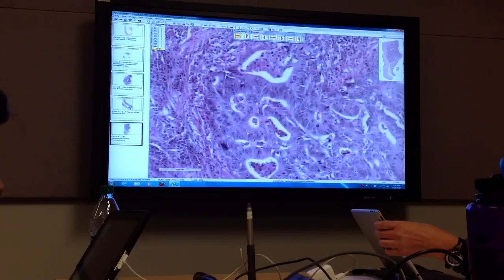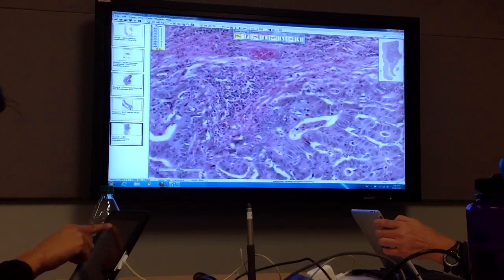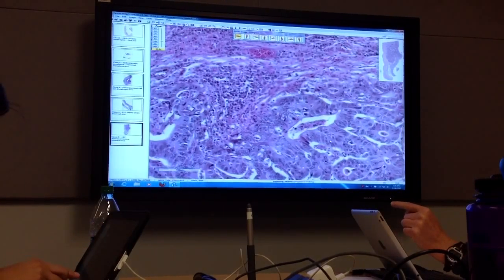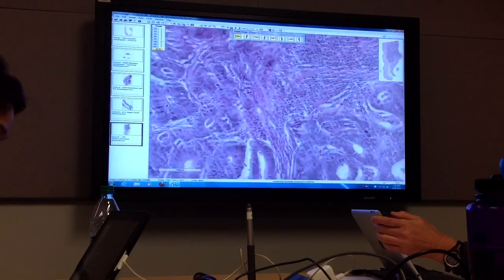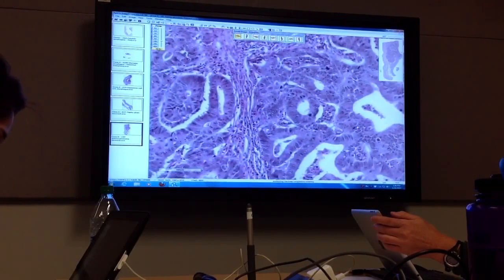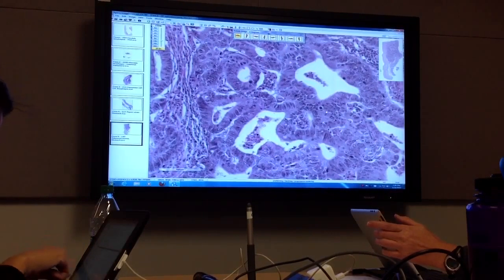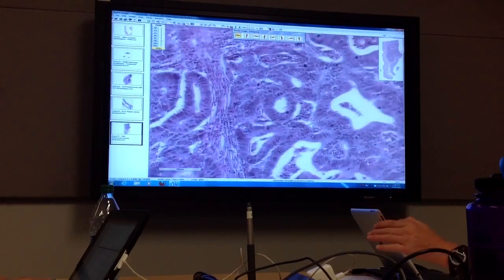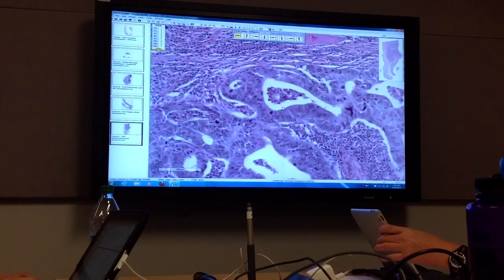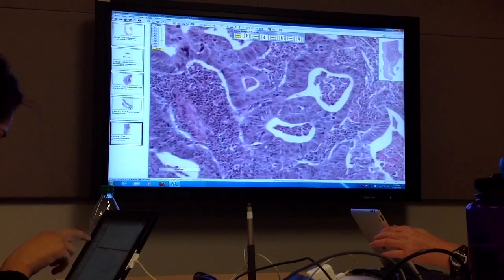And one of the clues that it's tumor is that the cells don't quite look exactly all alike. They get all piled up. There'll be different sizes, shapes. Some of them will be darker than others. Okay. Everybody feel like they've got a good handle on what a cancer cell might look like? Okay. What cytoplasmic secretion do you see, it says? It's really not, it's just kind of necrotic debris. It's really kind of just that.